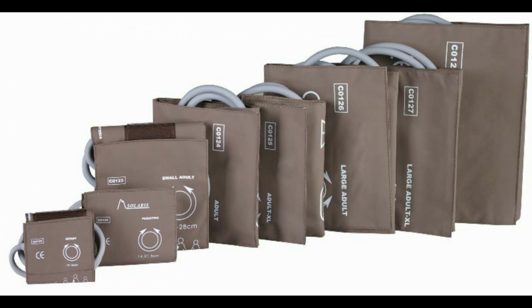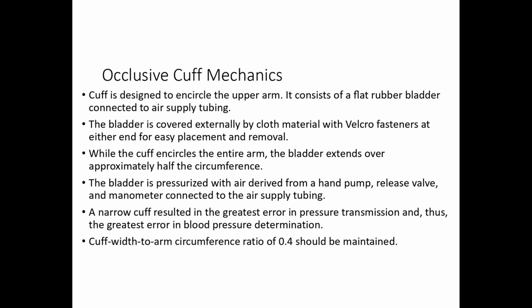A narrow cuff or an inappropriate size cuff can bring the greatest error in pressure transmission, and because of that the greatest error in blood pressure determination by the sensor or the pressure transducers of these patient monitors. The cuff mechanism is the important part of the measuring.